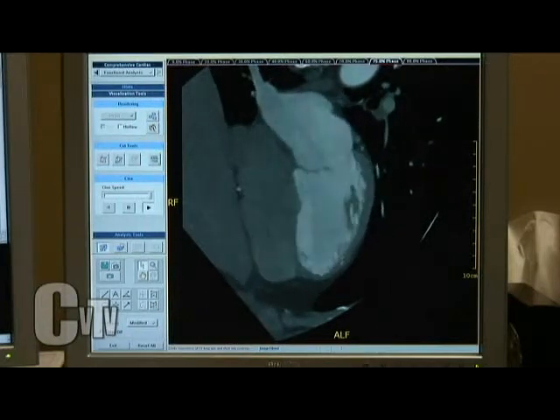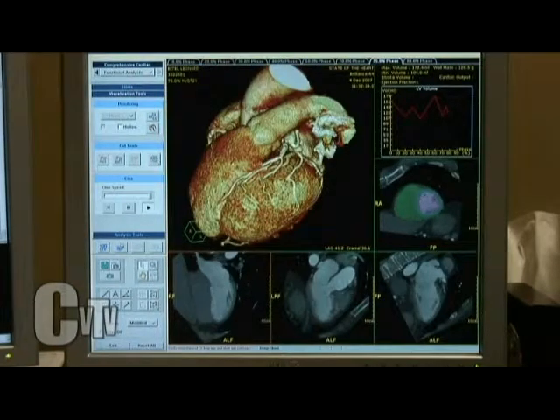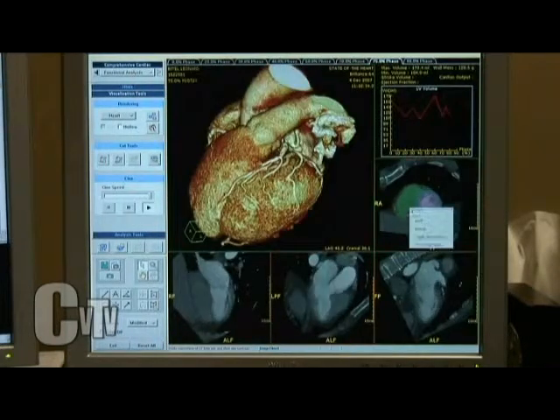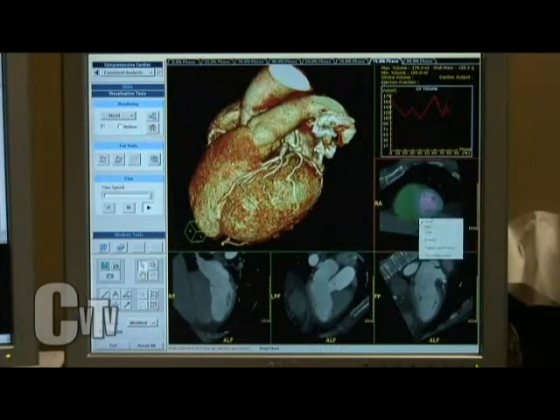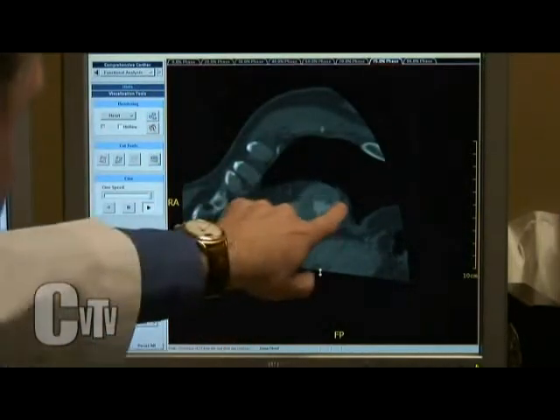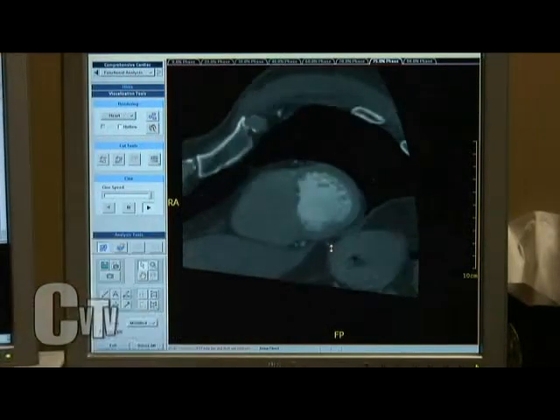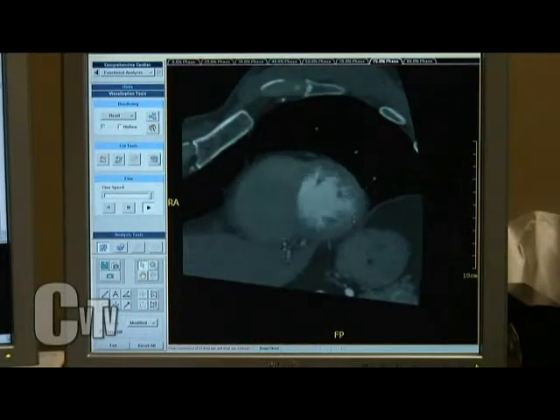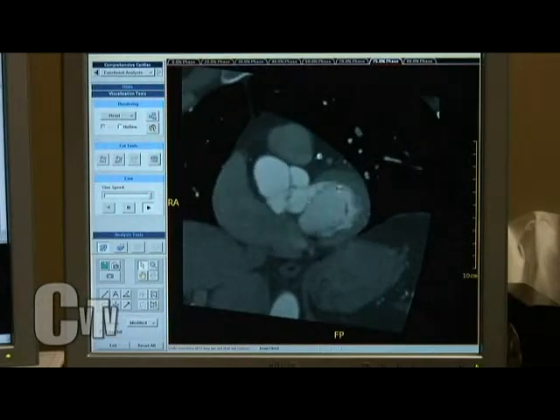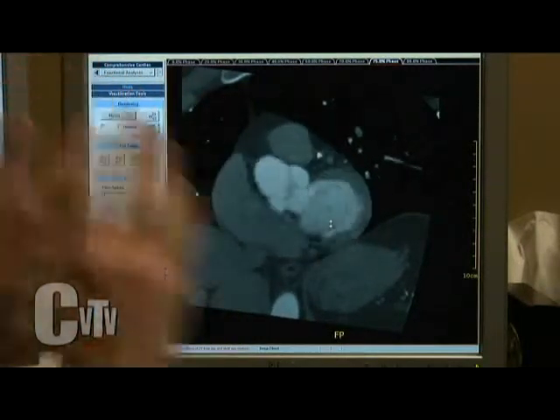We can make sure that there's been no heart attack or heart damage. I can look around the heart, make sure there's no inflammation around the heart or in the pericardium. This view shows us the aortic valve opening and closing, so it's all dynamic. In this view, we can literally take the heart like a loaf of bread and chop it up. This is the very tip of the heart. This is the left ventricle, the right ventricle here. We can look at all the different parts of the heart muscle to make sure there's no evidence of any heart attacks, heart damage, or anything like that. This structure right here is the mitral valve. We're sitting below it, and we can watch that mitral valve open and close.